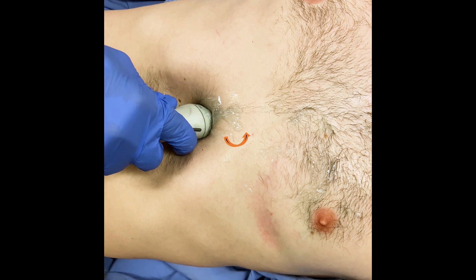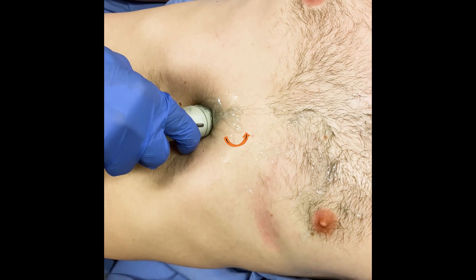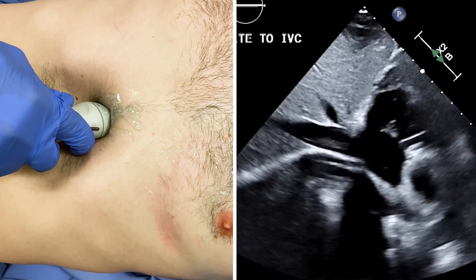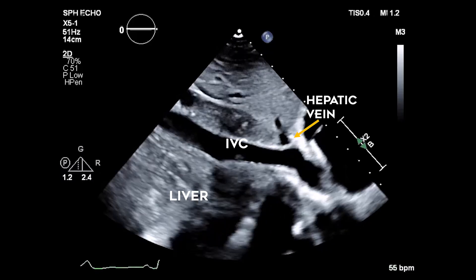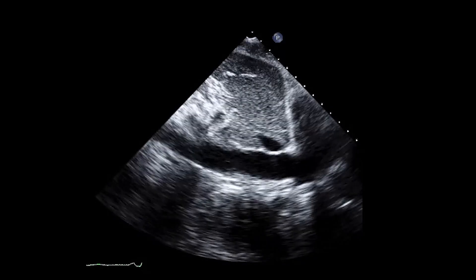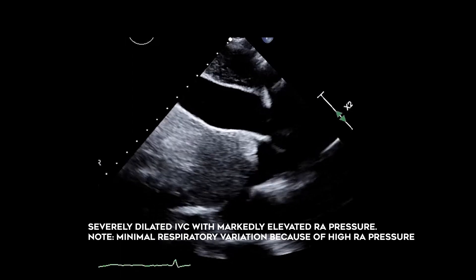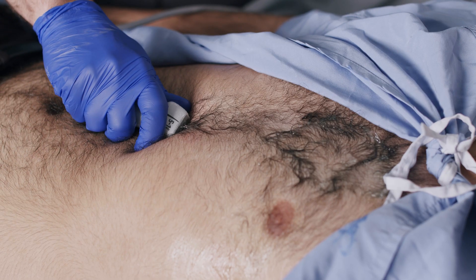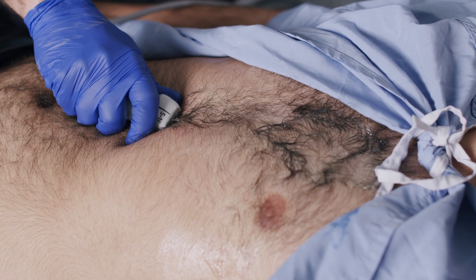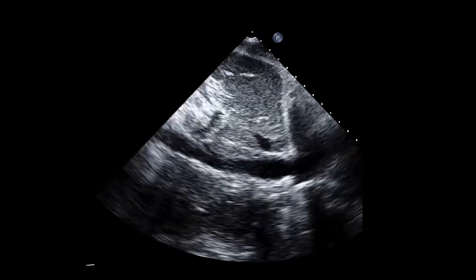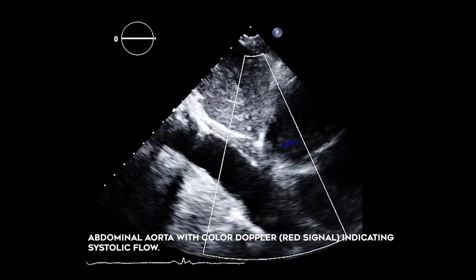If we rotate the probe through 90 degrees with the probe pointed towards the head, positioned or angled just to the right of the midline, we will see the IVC. The liver now forms the acoustic window as the IVC runs through the liver. Use small rotating and tilting motions to open out the IVC maximally. The IVC size should decrease with quiet inspiration, unless the right atrial pressure is very high or the patient is ventilated. Presence of the middle hepatic vein coming in perpendicular to the IVC, and the fact that the IVC is intrahepatic, are other clues to confirm you are looking at the IVC and not the abdominal aorta. If possible, acquire more beats to encompass the full respiratory cycle.